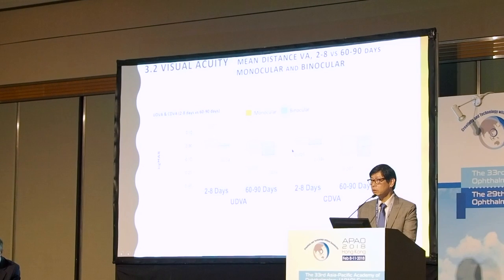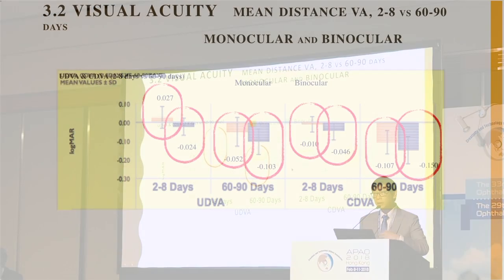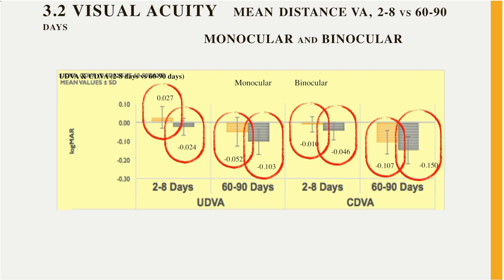This is really important. If you're going to test the lens, you should be able to report good vision. This is in logMAR, but I'll give you a translation in Snellen, which is more acceptable to clinicians. On the first visit, testing each eye separately, the vision is about 20/20, just slightly less than 20/20, monocularly. And at the last visit, after 60 to 90 days, it improves to between 20/20 and 20/15. For binocular vision, you start right out with 20/20 vision, improving to about 20/15 at the third visit.